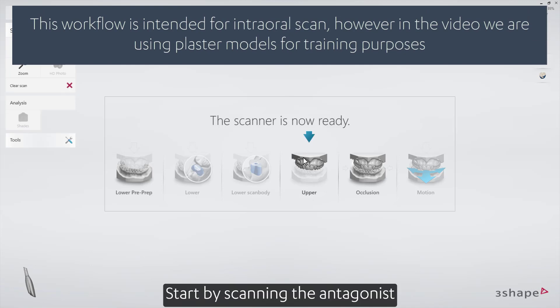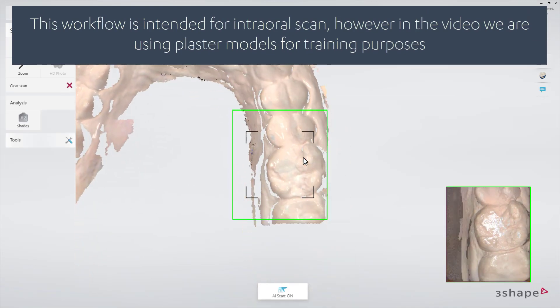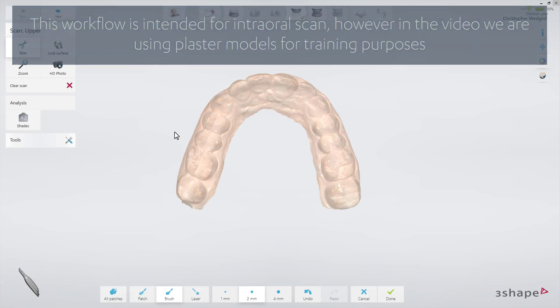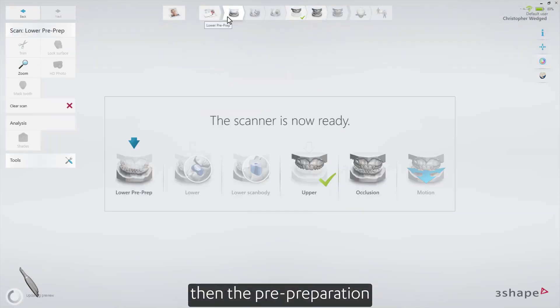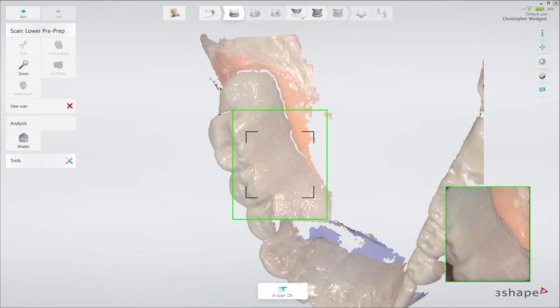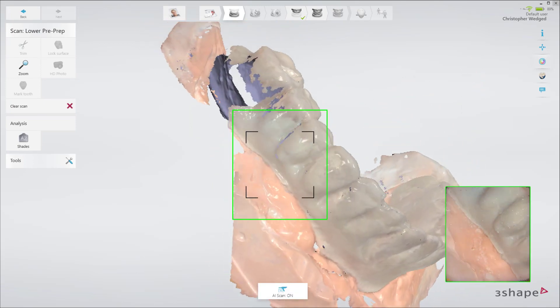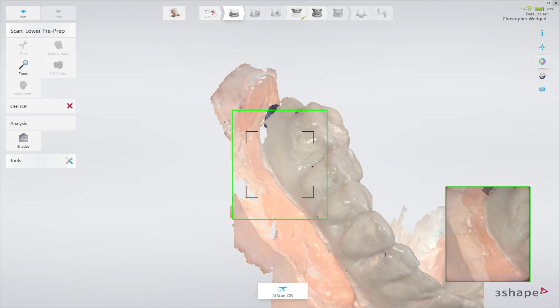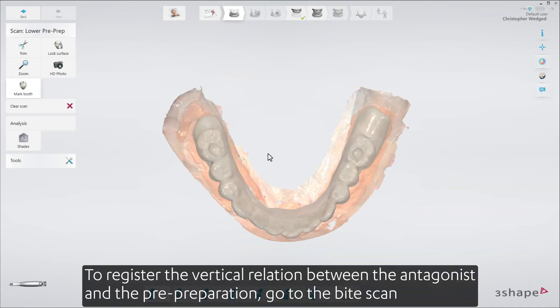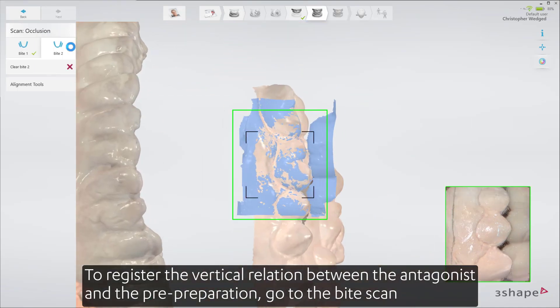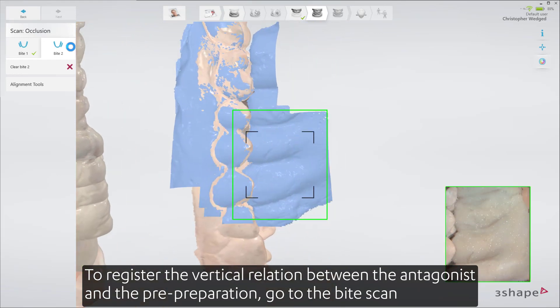Start by scanning the antagonist, then the pre-preparation. To register the vertical relation between the antagonist and the pre-preparation, go to the bite scan.